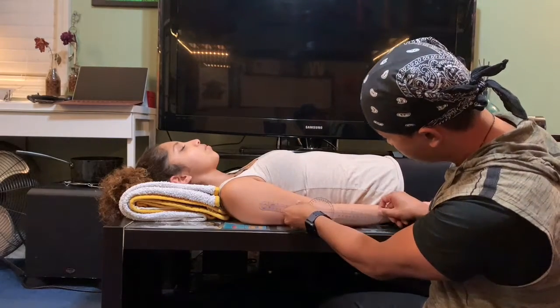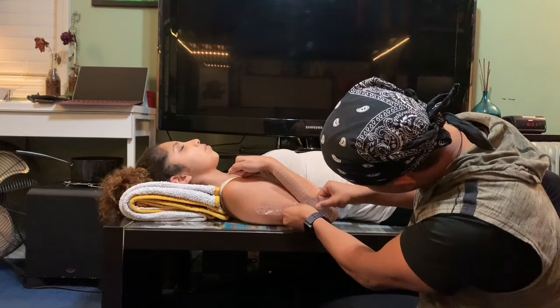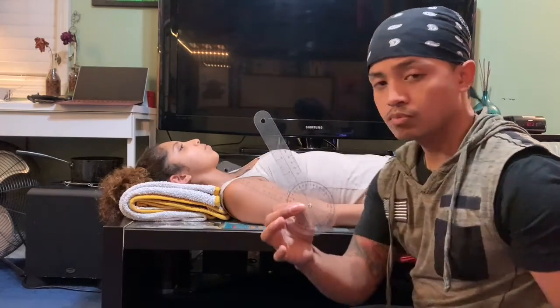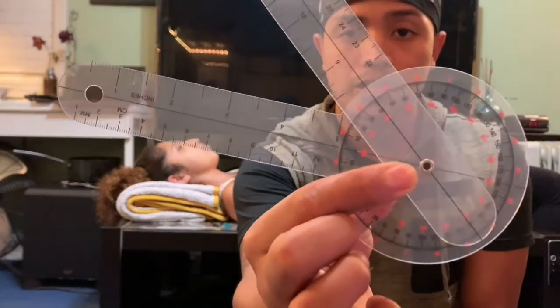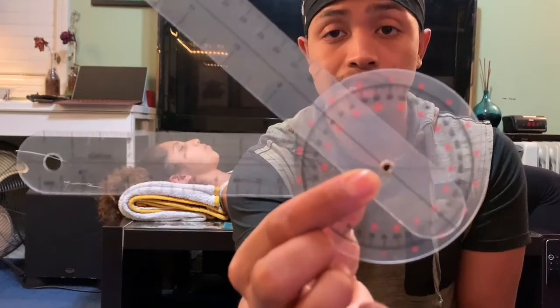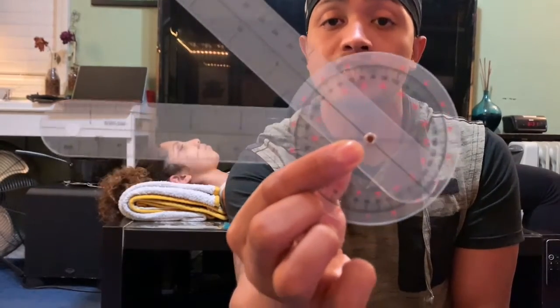Go ahead and flex. We are measuring at 40 degrees. We started at 180 degrees. This means that her range of motion is 140 degrees for elbow flexion, which is standard measurement.